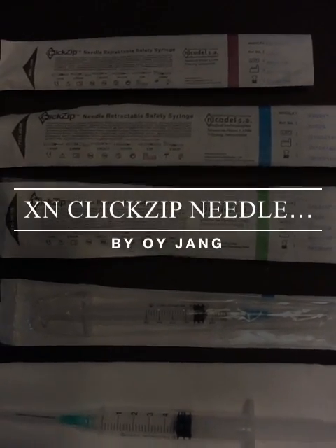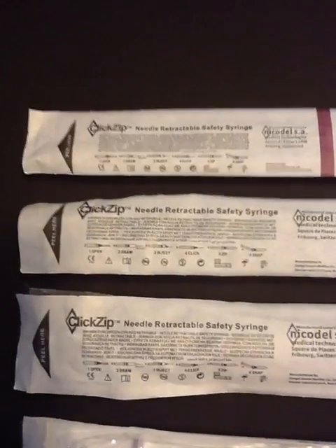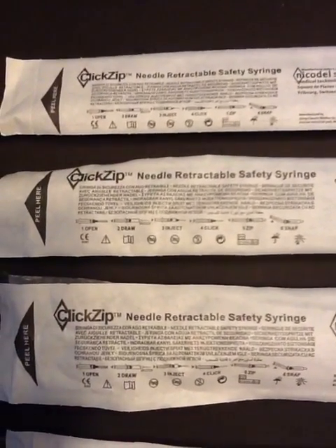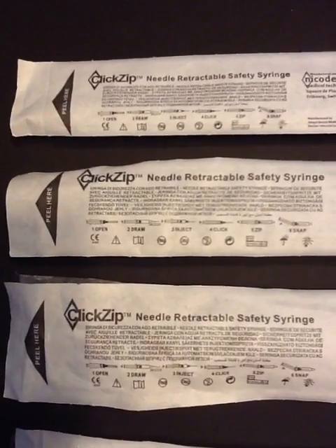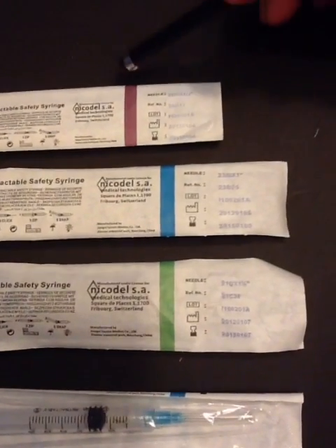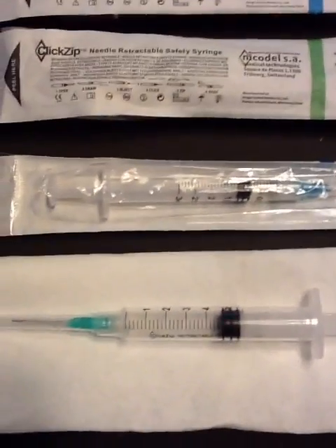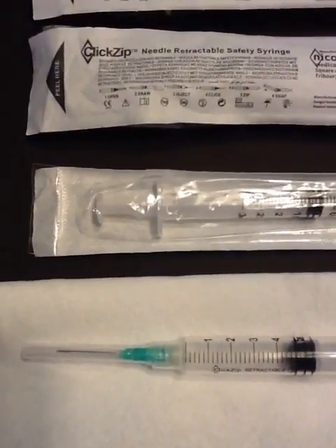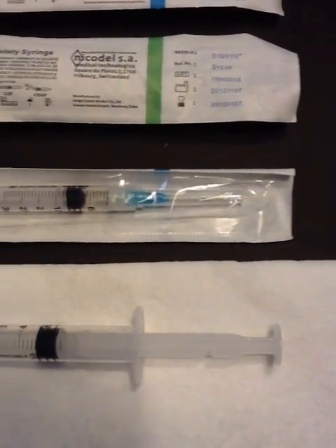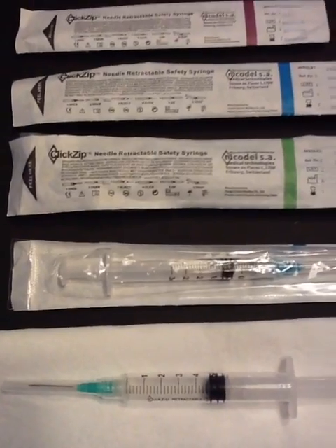Today we will introduce the new Safety Syringe XN ClickZip Needle Retractable Safety Syringe. The product is packed with blister paper and we identify the size by these color strips. This syringe was invented to reduce the possibility of an unwanted needle stick injury and to prevent its reuse. It works as a standard syringe other than this safety feature.